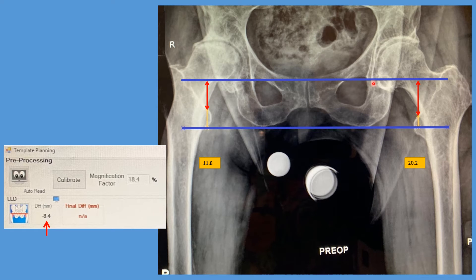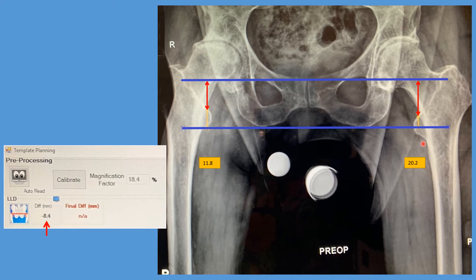Now this is the interesting part. We take that perfectly balanced image and download it into our computer guidance system, where we can begin to take very quantitative and precise measurements. We draw a horizontal line across the base of the pelvis at the same landmark on the right and left side, then look at the length of the femur based on a landmark called the superior pole of the lesser trochanter. From this, we can see about 20 millimeters of length on the left and 11 millimeters on the diseased side — because this hip is collapsed, this right side is shorter. The computer tells us it's 8.4 millimeters shorter. That's our starting deformity and the amount of length we need to correct.